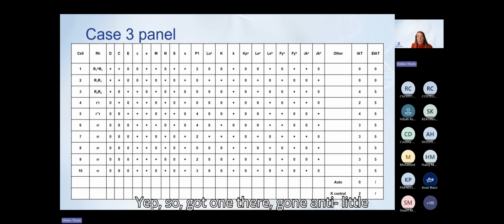Yeah, so it's got a good one. They've gone anti-little c, anti-big E, anti-big E and little c, a couple of little c's, and anti-little c big E compound. That's an interesting one. Oh, a couple of little c's there. Good answers. Thank you, everybody. So I'll just close that poll there. Sorry for anyone who's not had a chance to answer there.